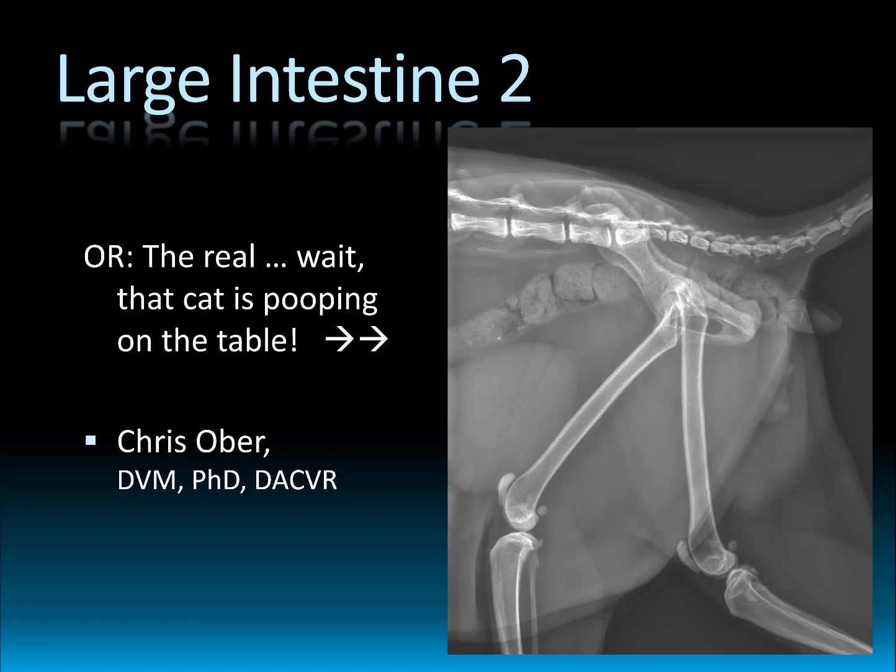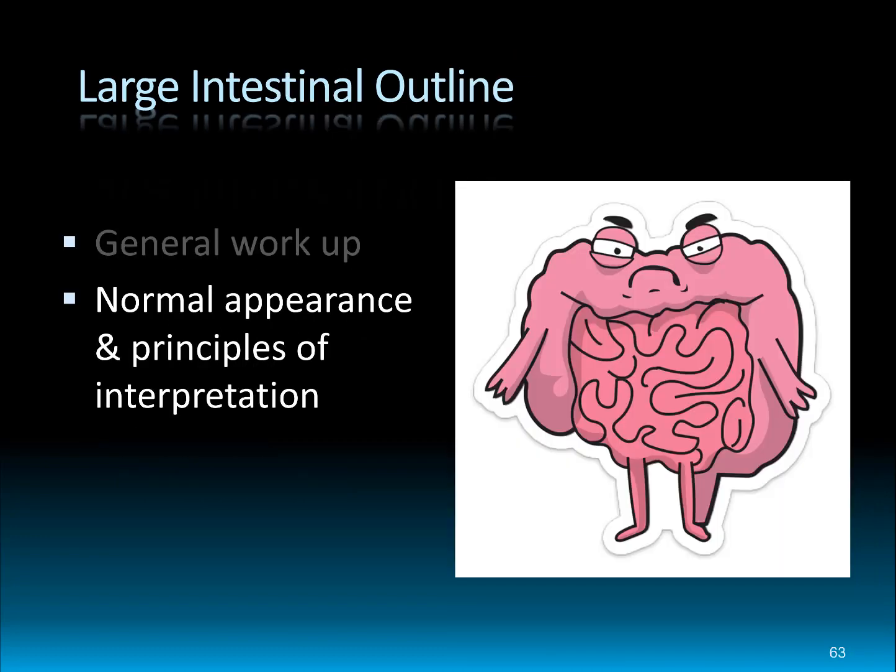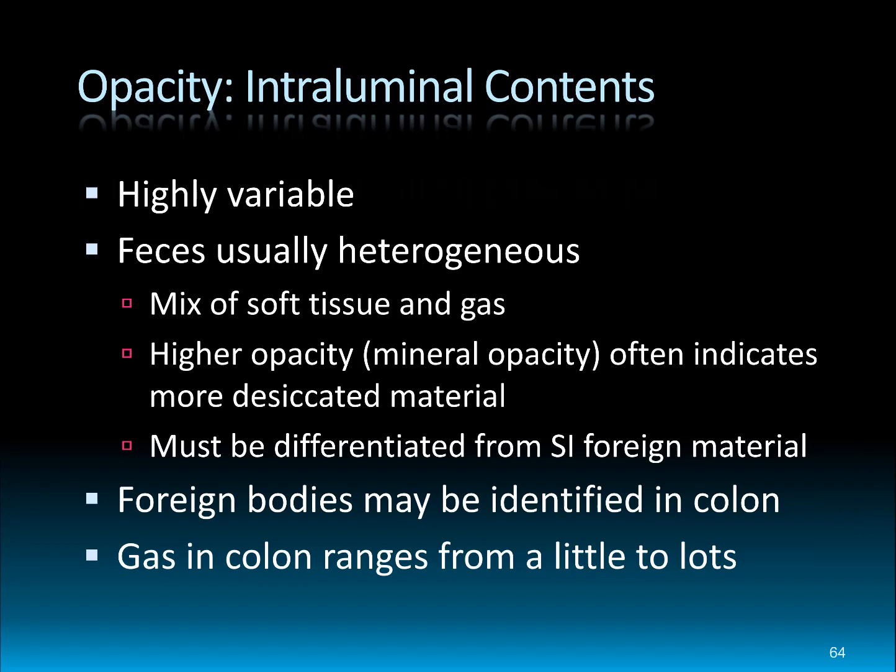In this second portion of the large intestinal lectures, I'm going to continue talking about the normal appearance of the colon and the abnormal appearance that you will see in various disease processes. So again, it's a continuation of kind of what we've been doing before.